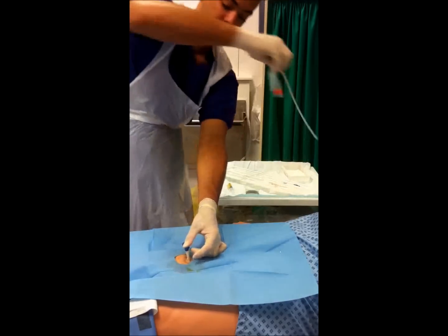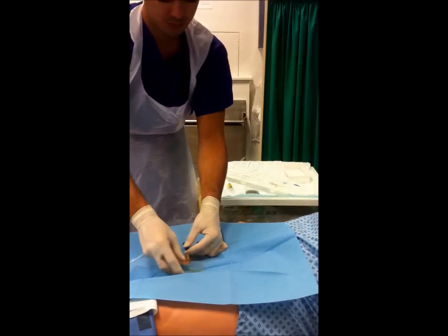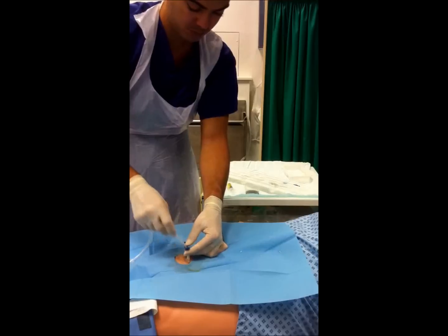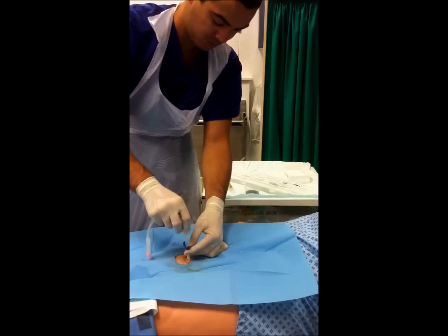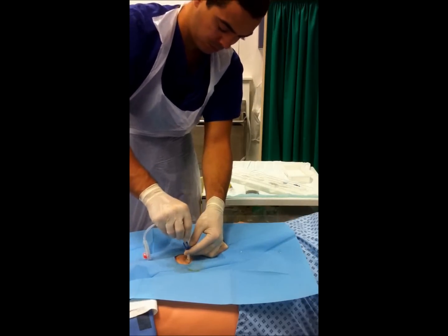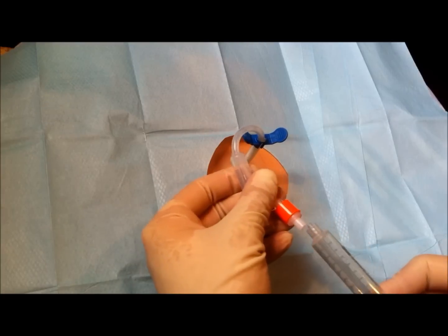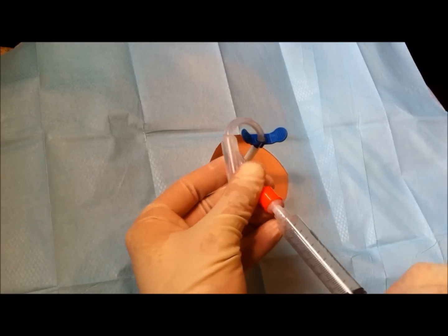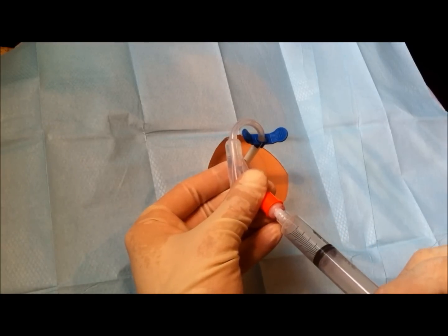Remove the trocar and cover the hole with your thumb while reaching for and inserting the catheter. Once the catheter is in, inflate the balloon with 10 ml of water for injection, then peel away the sheath.